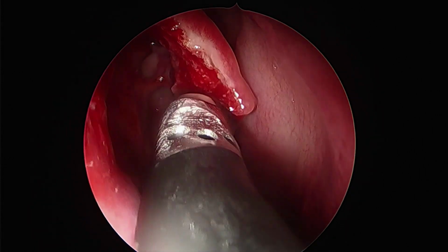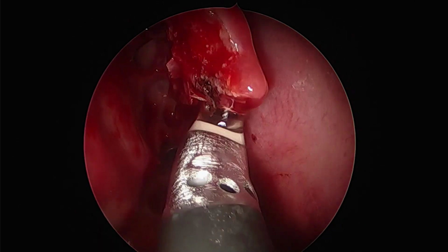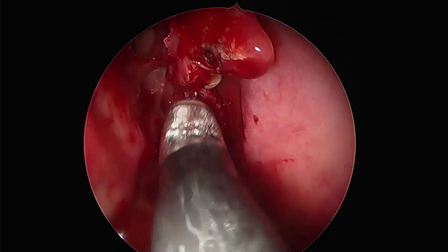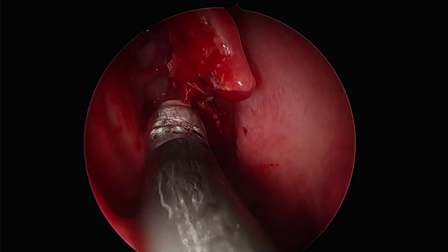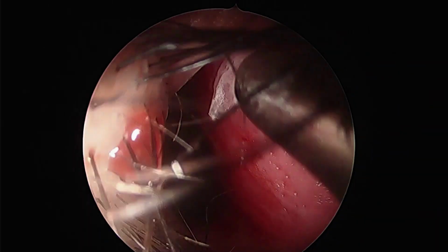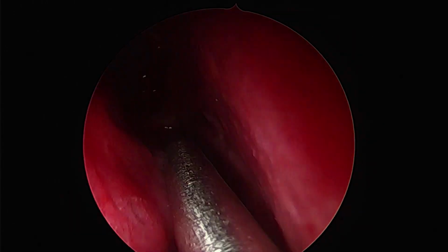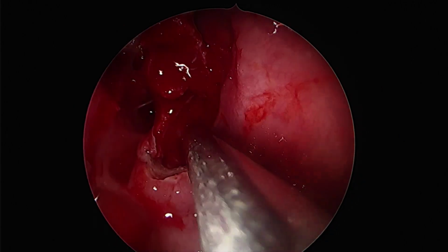Again, just trying to achieve some more hemostasis on the resected ends of the middle turbinate and the bare mucosa. The coagulator works only on the mucosa and not on the bone, so there's no purpose using it on the bone. Once we have achieved the hemostasis broadly, we get back to our sphenoid os. You can see the choanal arch here.